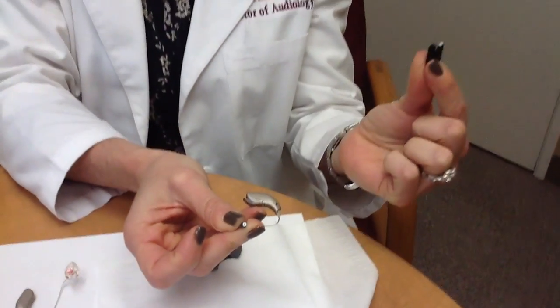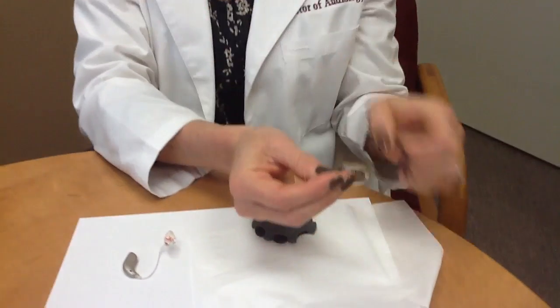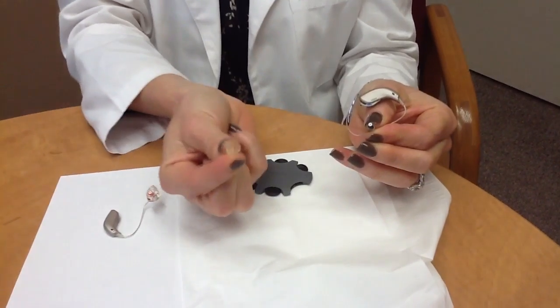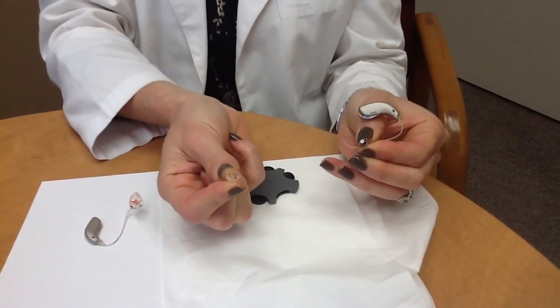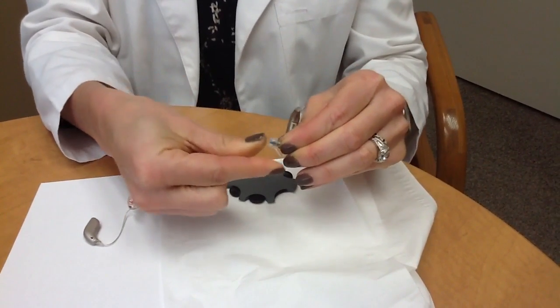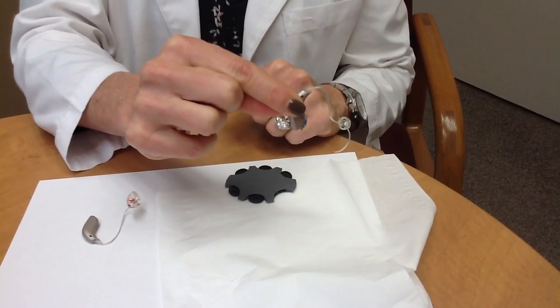Again, you want to throw away the old wax guard. Now you want to put the dome of the hearing aid back on to the end of the receiver. You simply line it up in the middle and push it all the way on. And now you've changed that wax guard.